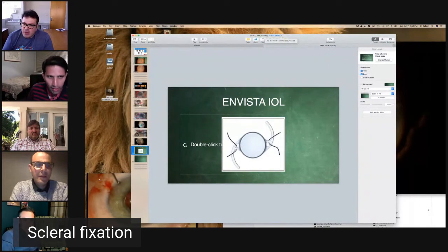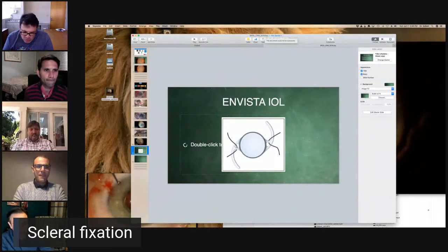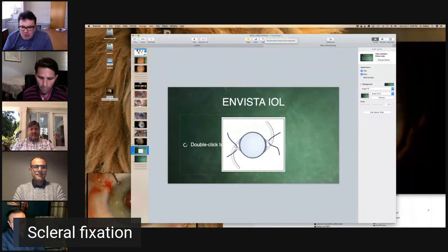One good point about contact lens is that it's good to test the water to know what the vision is like, right? Especially when you don't want to go for a lens and then you're not really sure about the retinal function, especially if patients had surgery before. So it's really good to test the water and get the patient to experience what the vision would be like if you put a lens in.